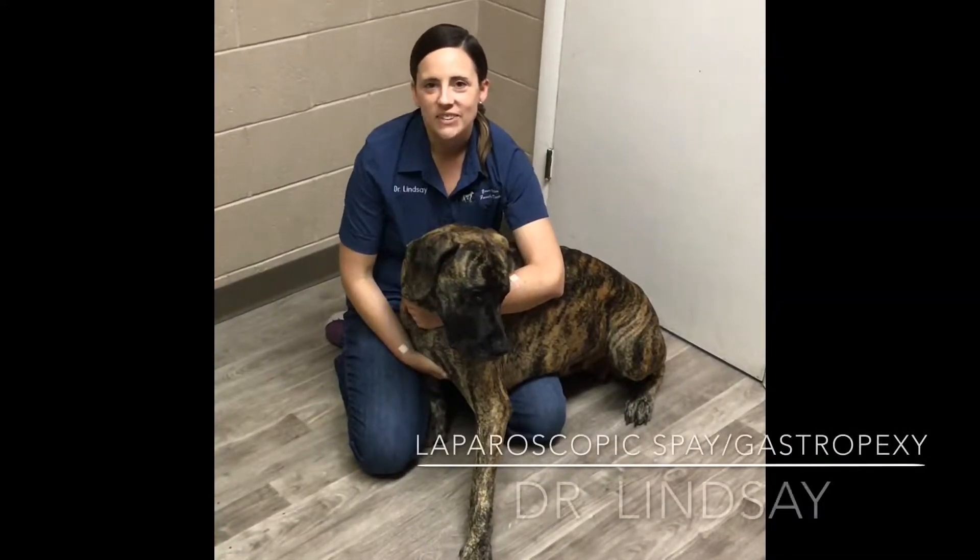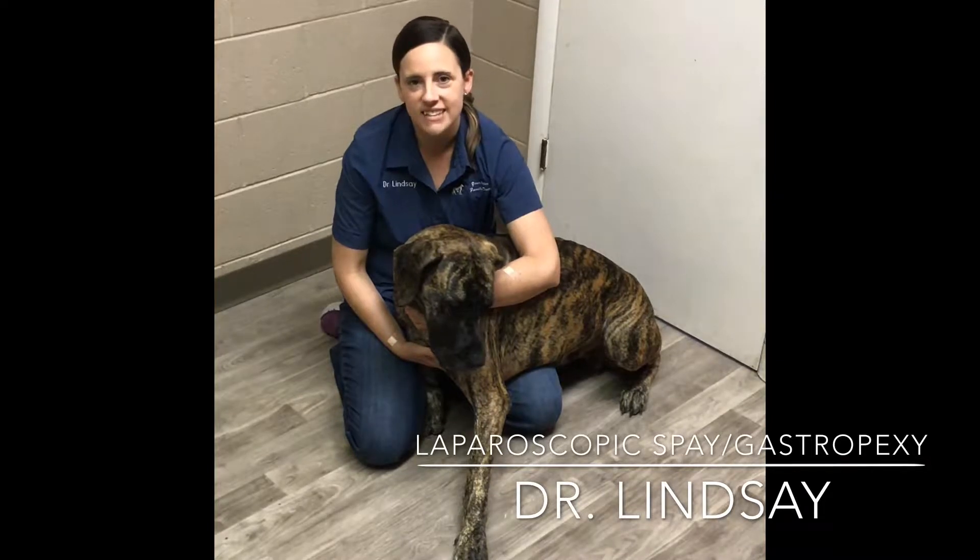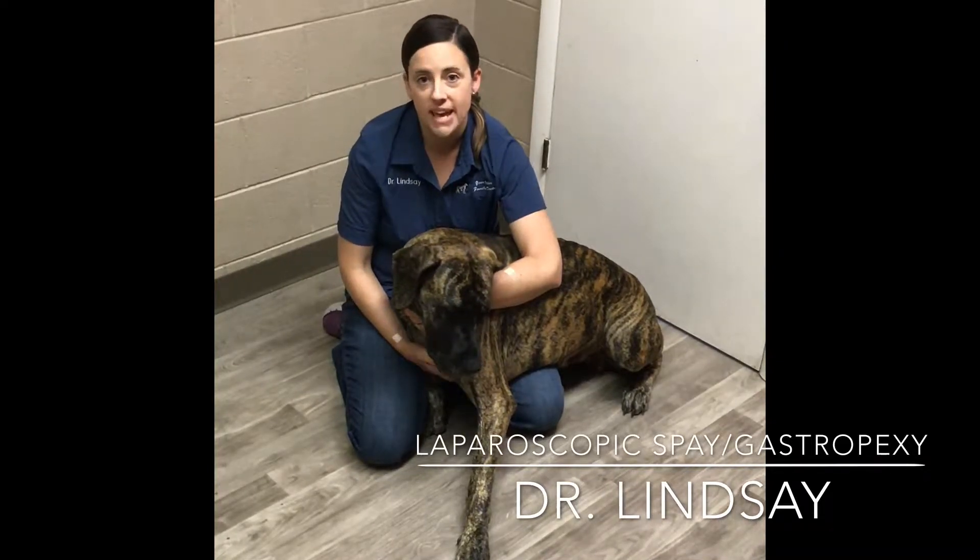I'd like you guys to meet Scout. She's a Great Dane who's here with us today to get a laparoscopic spay and gastropexy.